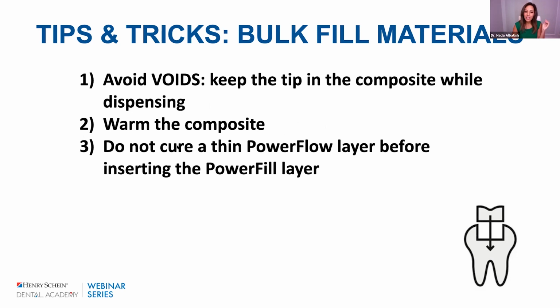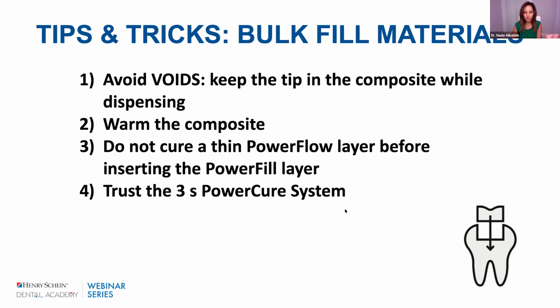The other thing to consider, you don't have to do this, but you may want to try it because some clinicians love this and swear by it. If you put a thin layer of the flowable before you insert the power fill layer, the bulk fill packable material that we're talking about, and you don't cure it, then when you inject the packable composite, it displaces the flowable composite and it goes into any nooks and crannies and also helps prevent the formation of gaps, marginal gaps, and air bubbles.